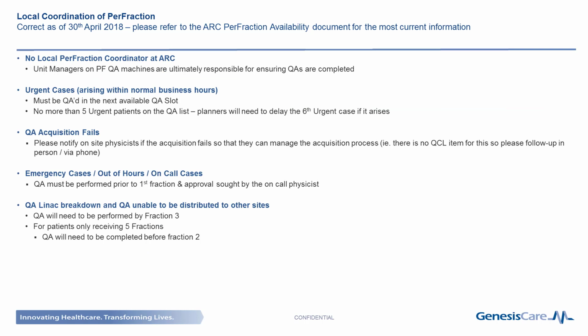It is important to note at ARC there will be no nominated local ARC PerFraction coordinator. The unit managers on PerFraction QA machines are ultimately responsible for ensuring QAs are completed. ARC has developed additional business rules to assist with the management of PerFraction.